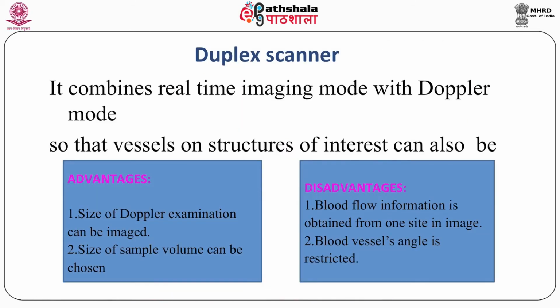Coming to the duplex scanner, some Doppler equipment combines a real-time imaging mode such that vessels or structures of interest can be selected. Duplex Doppler is a single gated pulse wave Doppler.